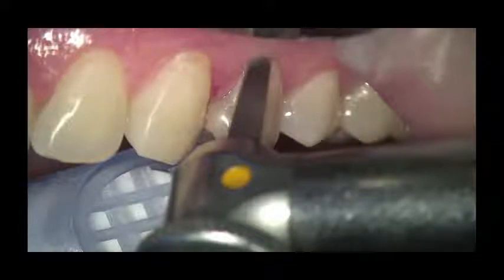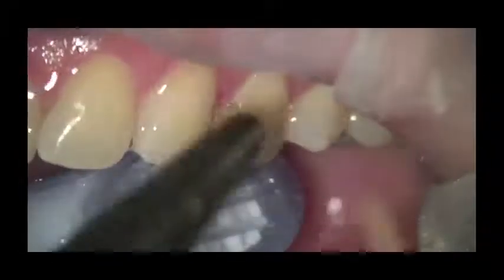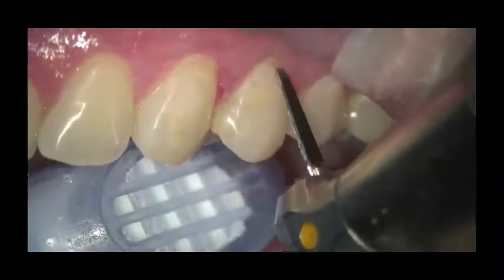And when you're using the finer tipped version of this, it works really well. So I'm going to show you a couple of slides in a moment which show you what this looks like. And basically the handpiece is made by Cavo, and then the tips are made by a European company, and they're manufactured in North America, or sold in North America through Access Dental. So you can see how nicely this works, and it just kind of planes away the restorative material without damaging the root surface.